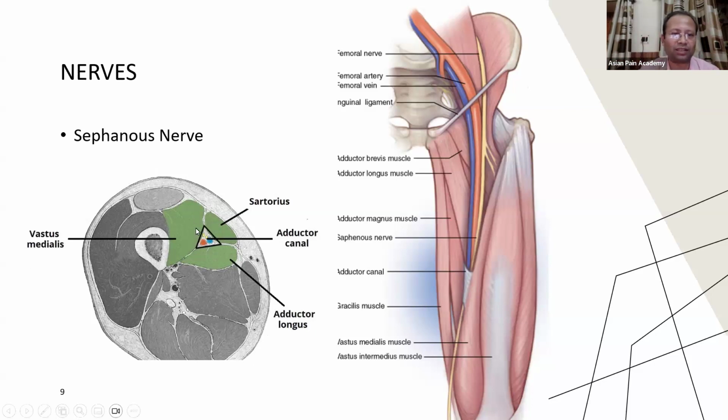These medial group of muscles, when we come down from the knee to the ankle area, become medial, but otherwise they are the deep muscles of the posterior compartment.